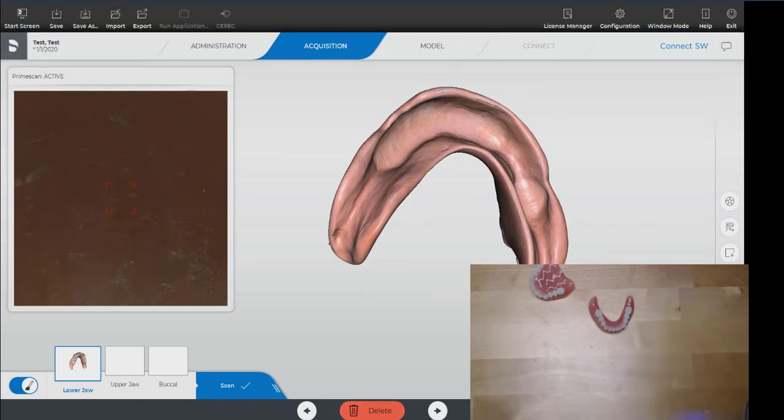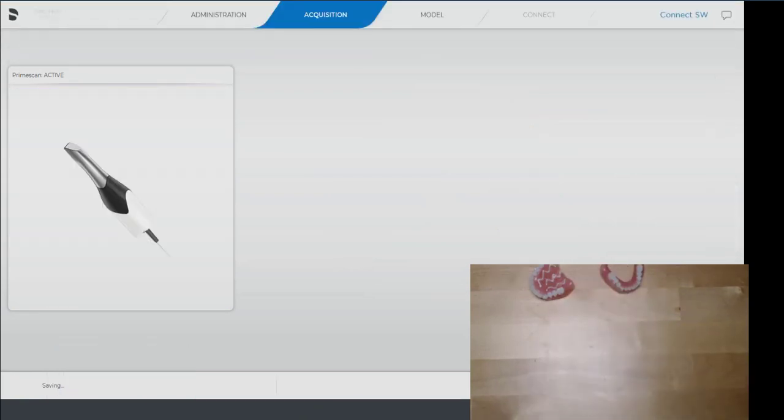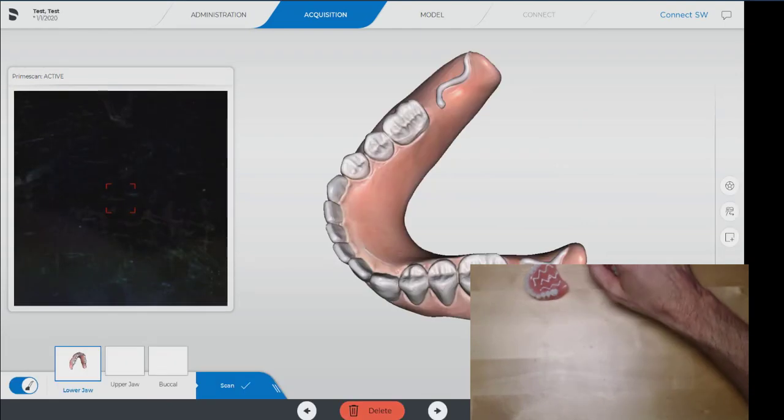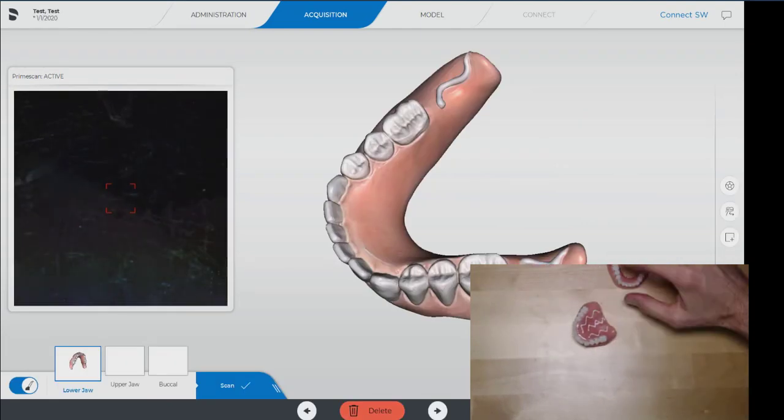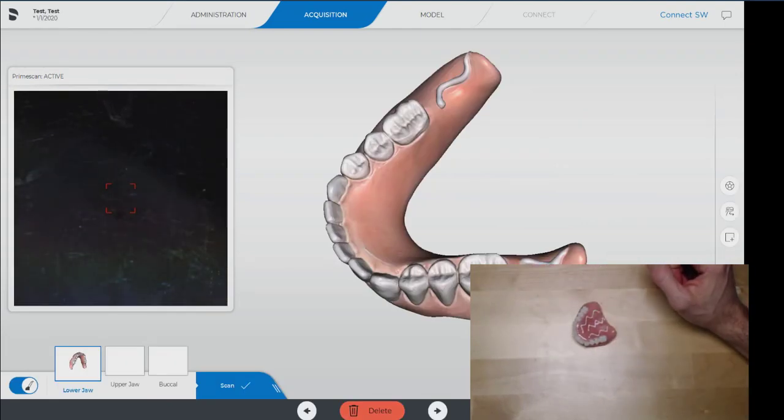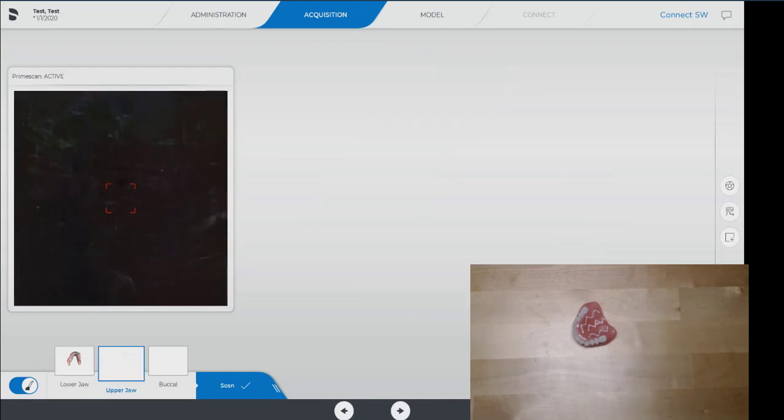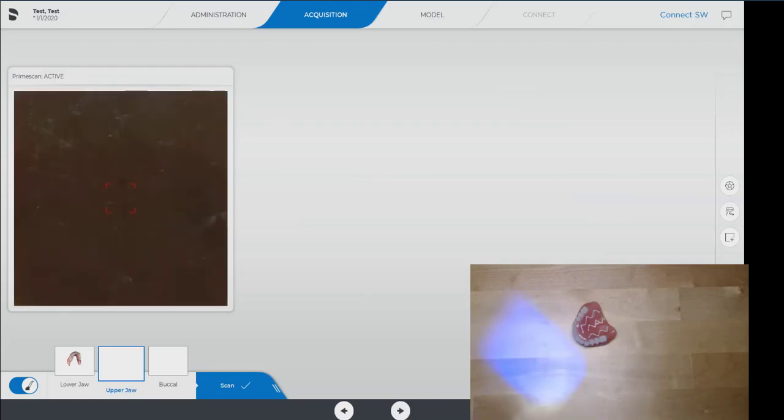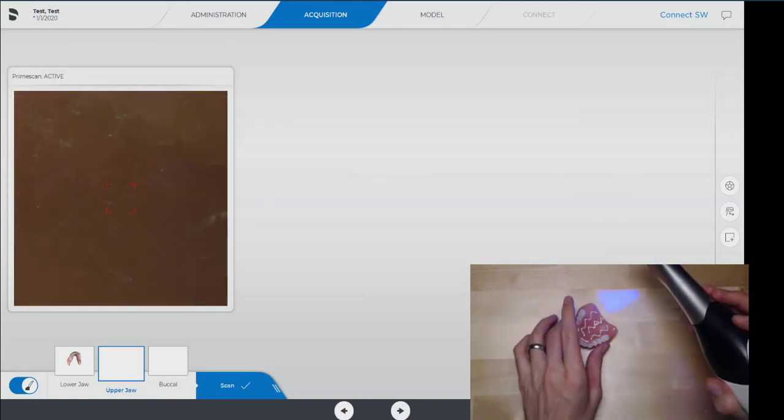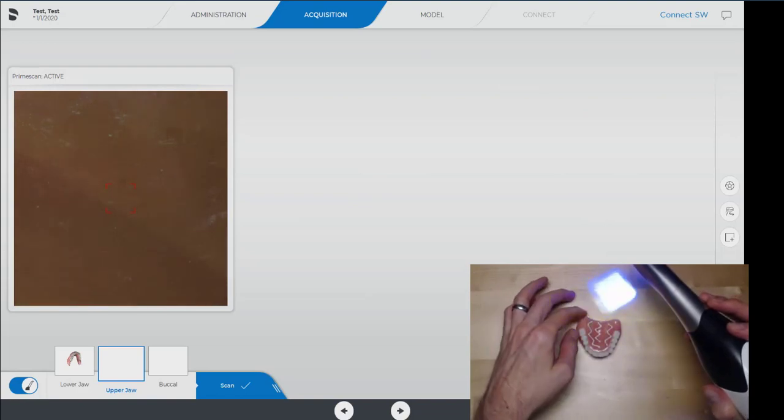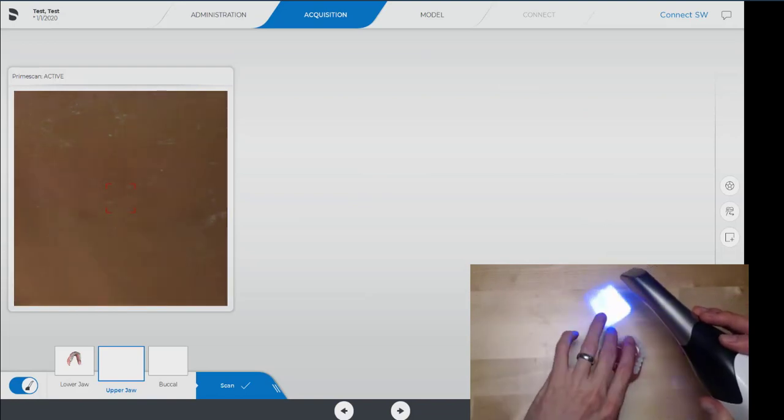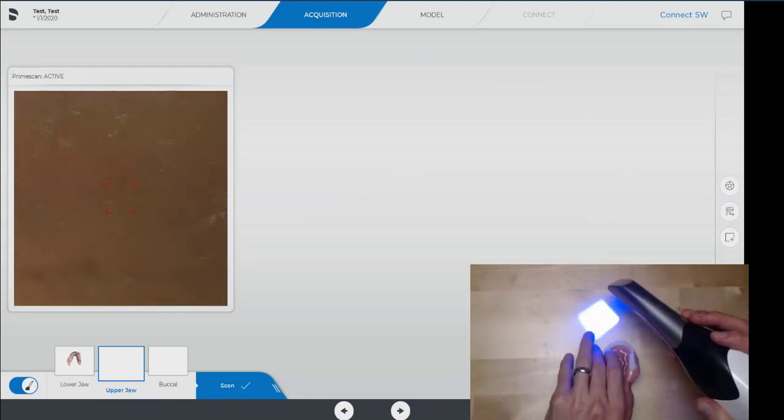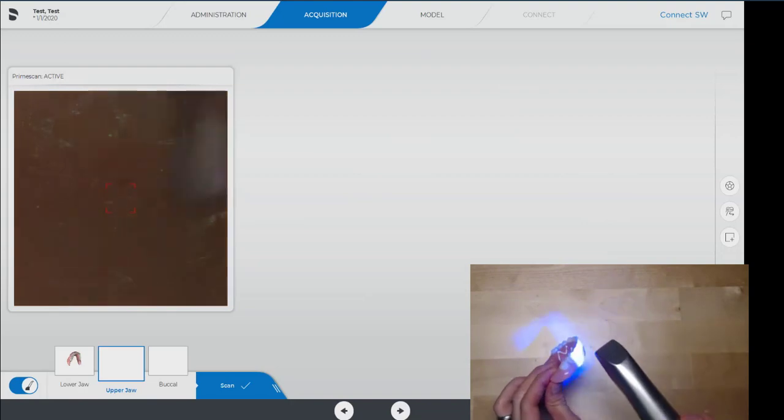Now we always want to save after we do an arch. I found that in Connect it's wise to save after you finish scanning an arch, because if you're almost done with your second arch and things disappear on you or the computer crashes, it can be disappointing to say the least, particularly when the patient's trying to be patient with you.